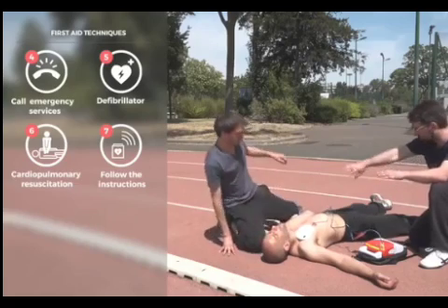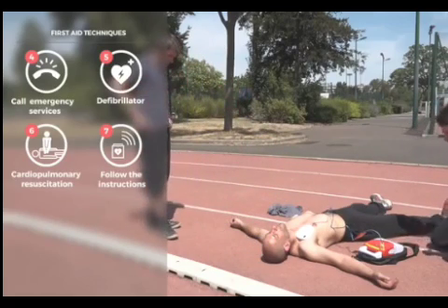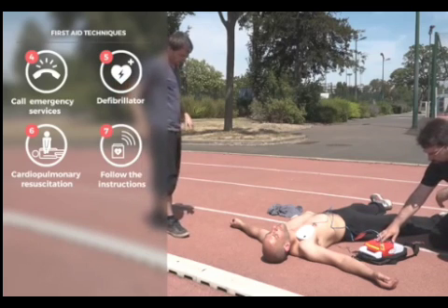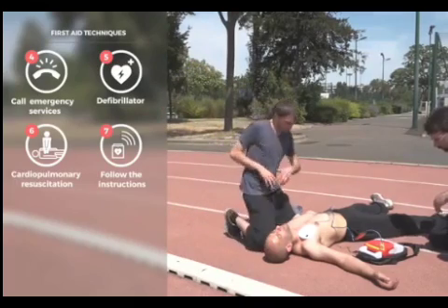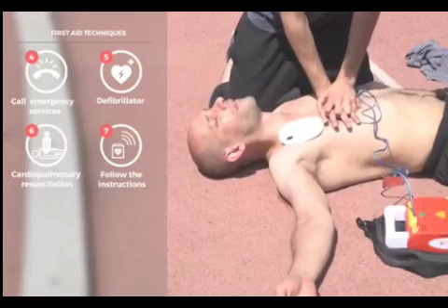Make sure that nobody is in contact with the casualty while the defibrillator is analyzing the casualty's heart rhythm. Follow the instructions of the device, which will indicate whether you should administer a shock or continue with chest compressions. Continue in this way until the emergency services can take over, or until the casualty begins breathing normally again.